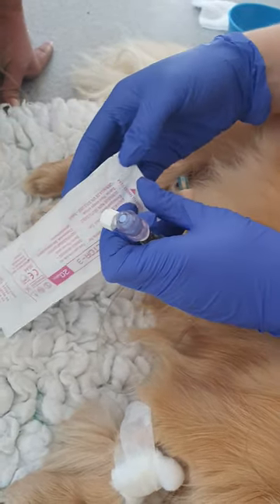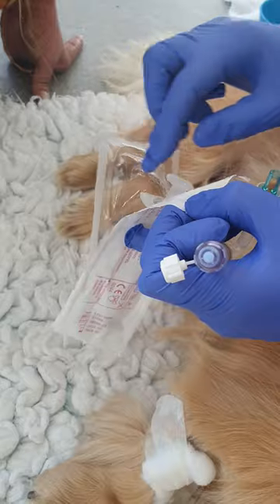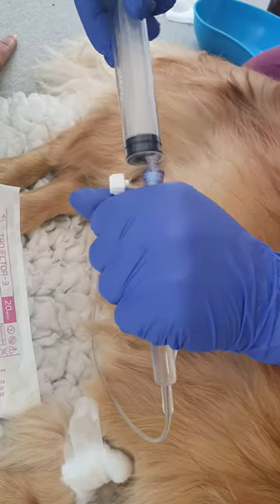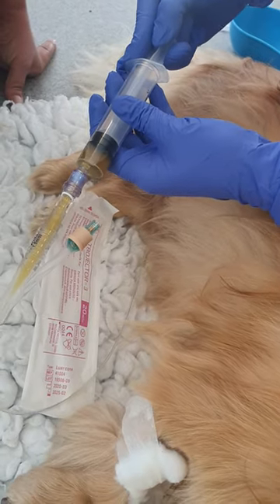We've got a little syringe here. If you keep the syringe in the packet when you're doing it, pop it back into this and try not to touch the inside. We'll just pop this on, give it a little bit of a twist like that, and just gently pull the urine out.